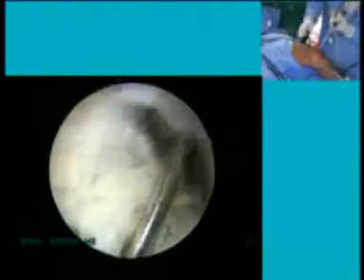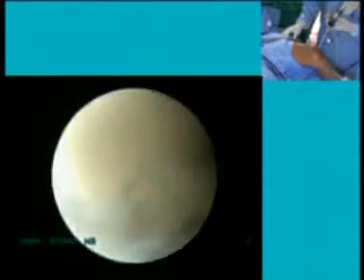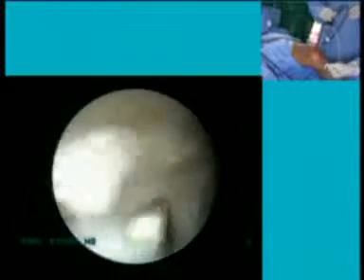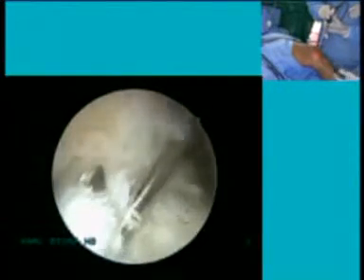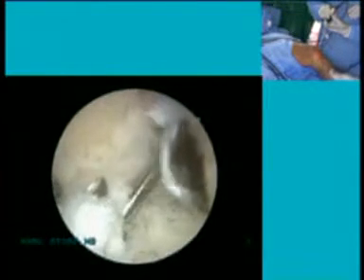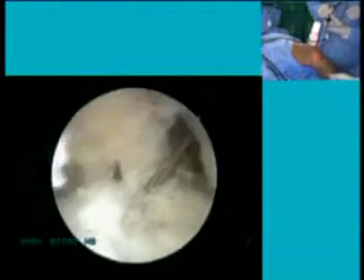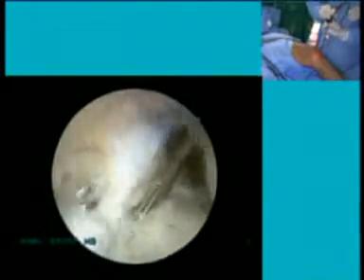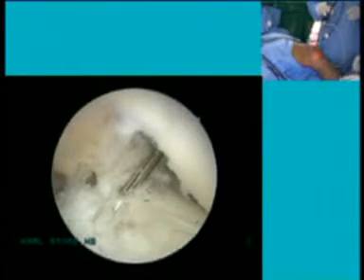So now I drill. Then I take the guide wire again. Now you can give me the 6 millimeter. You can see what you can do is, yeah, you're moving it posteriorly, perhaps. Yes, and then I drill again, and then my tibial tunnel moves very closely to the PCL. So I think, and maybe can you give me a probe?